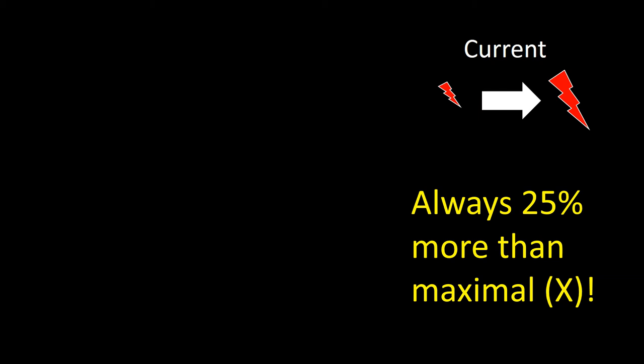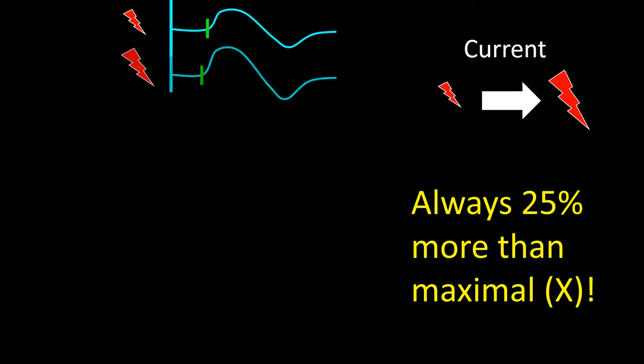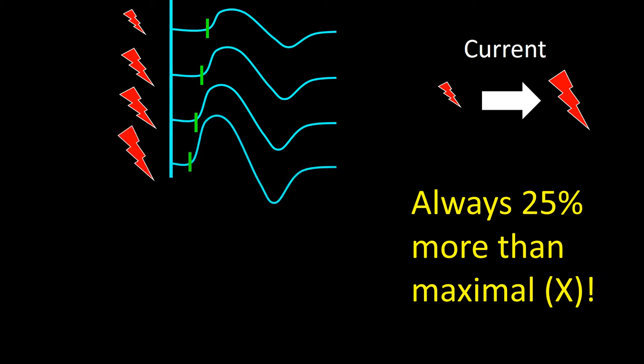The aim of nerve stimulation is to excite all fibers in a nerve. After locating a nerve, as we have mentioned before, the intensity of the stimulus is increased, and as such, the negative wave will also increase and it would also appear sooner. This process will continue in following trials as seen in this new frame.